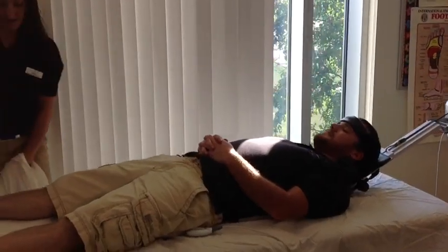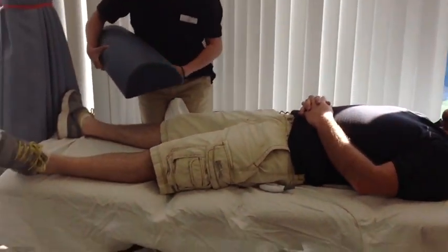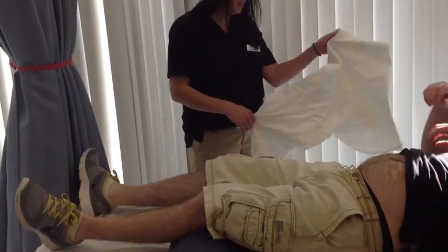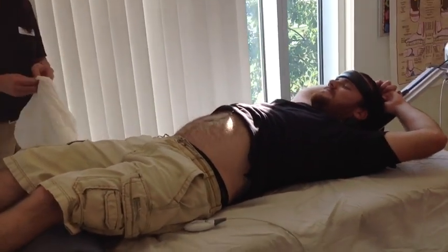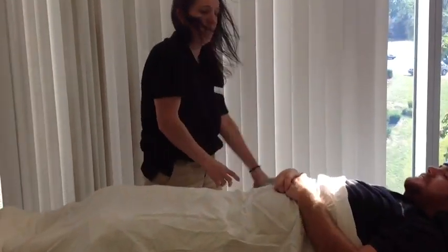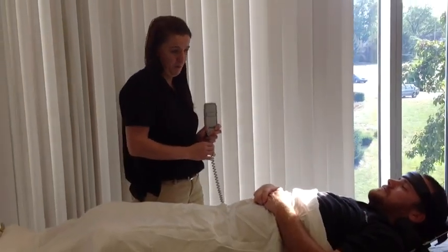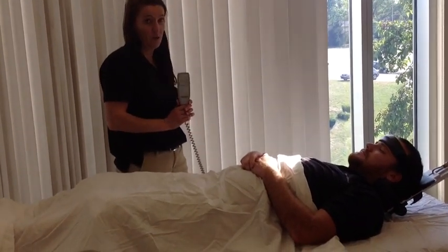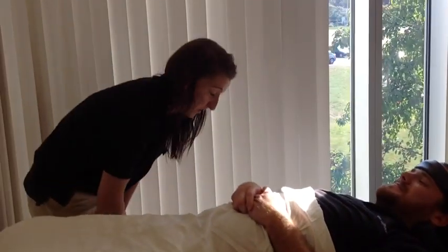Things to look for with your patient: first make sure they're comfortable — that might include putting a bolster underneath their knees. Also, you're going to want to drape your patients to protect modesty. On this specific table, it does have an up-down button — do not move your patient while they're in cervical traction unless you want to really hurt them.